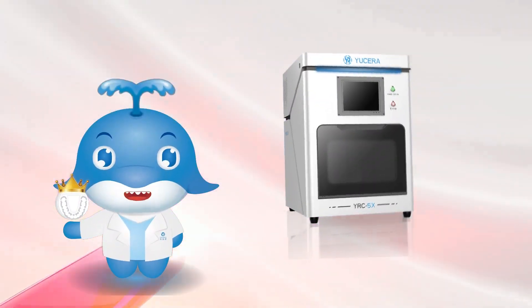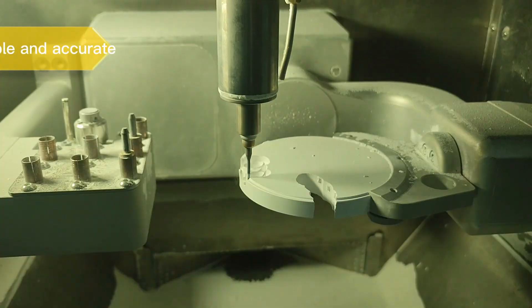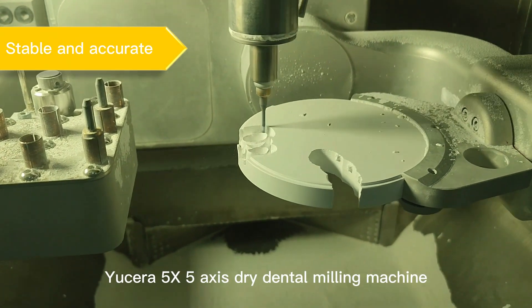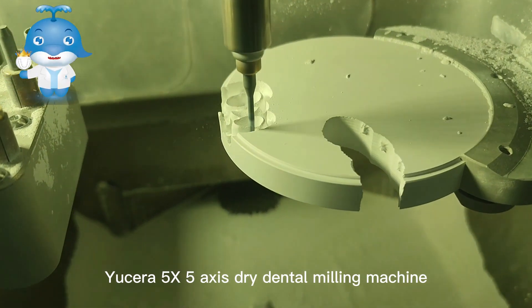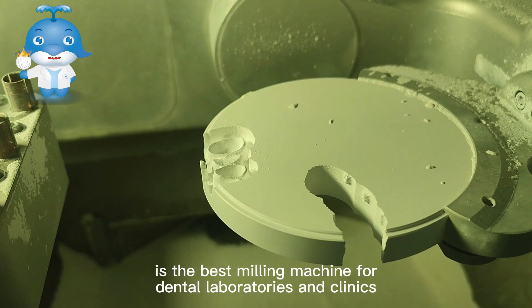Hello everyone, I am your friend Dean Ziyogin. Today I will introduce our new milling machine YRC 5X. The YRC 5X dry dental milling machine is the best milling machine for dental laboratories and clinics.